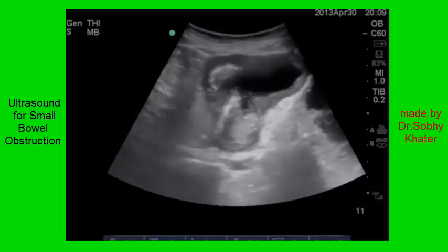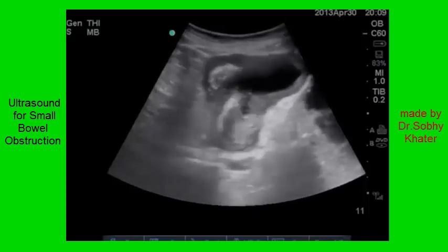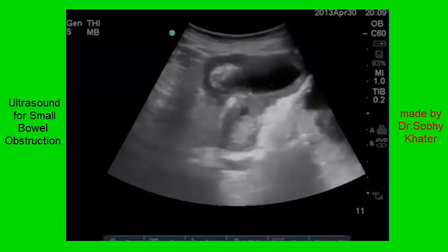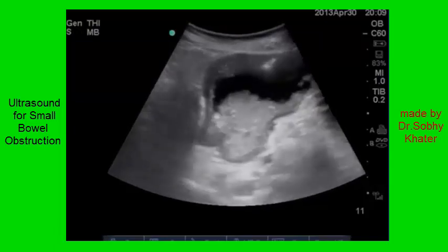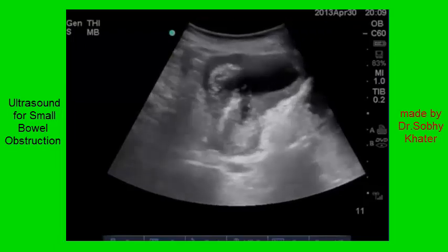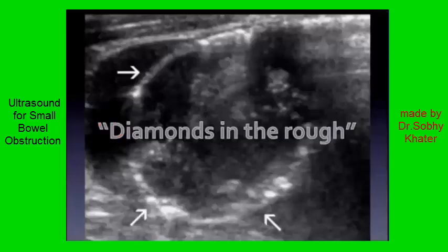One more clip here, and this one's a subtle but important one. Obviously abnormal bowel — yet again, fluid-filled, distended. You can see thickening of the wall, a bunch of echogenic material in there. But look at this bright, sparkling, highly echogenic stuff — not just in the lumen, but look at it in the wall as they sweep through this clip. What is that? It's air. This is pneumatosis. Here's a still shot with a better look — you can see arrows pointing to these hyperechoic areas in the bowel wall. This is what air looks like. This is a bad sign. I like to think of it as 'diamonds in the rough.'